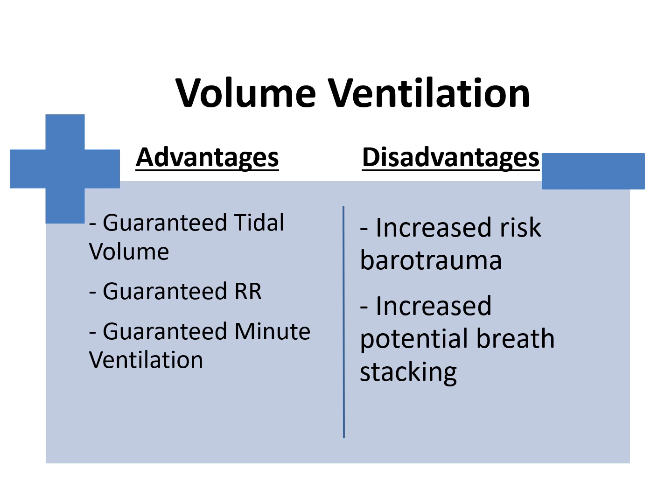The advantages and disadvantages of volume ventilation. So let's talk about the advantages. Because we are giving a set tidal volume, we have a guaranteed tidal volume. We also have a guaranteed minimum respiratory rate. Most generally, you'll have settings that allow the patient to go above that rate. But with a guaranteed tidal volume and a guaranteed minimum respiratory rate, you're going to get a guaranteed minimum minute ventilation, and that's going to allow your patient to have adequate ventilation. And we talk about ventilation in regard to blowing off CO2. Without adequate ventilation, whether in volume or rate, you can't rid the body of CO2.